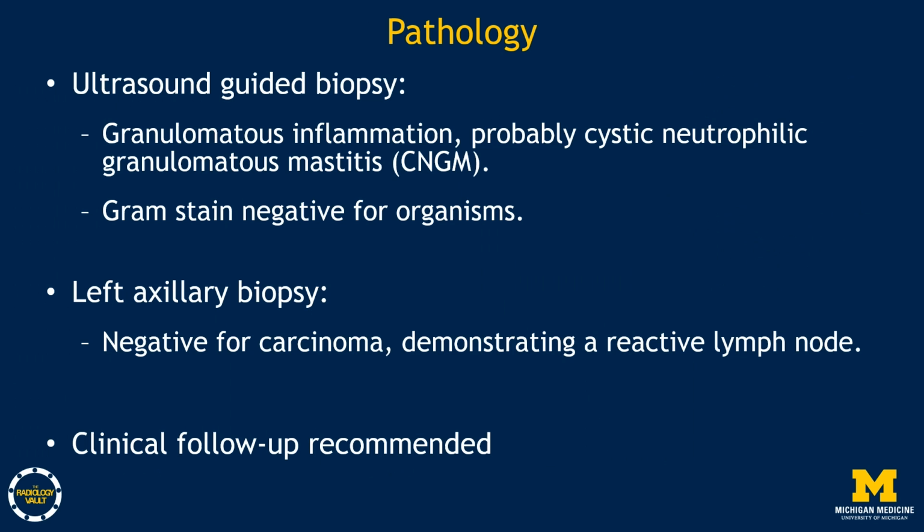The pathology from the ultrasound-guided biopsy for this case showed granulomatous inflammation, probably cystic neutrophilic granulomatous mastitis. The gram stain was negative for organisms, and the left axillary biopsy was negative for carcinoma, demonstrating a reactive lymph node, and clinical follow-up was recommended.